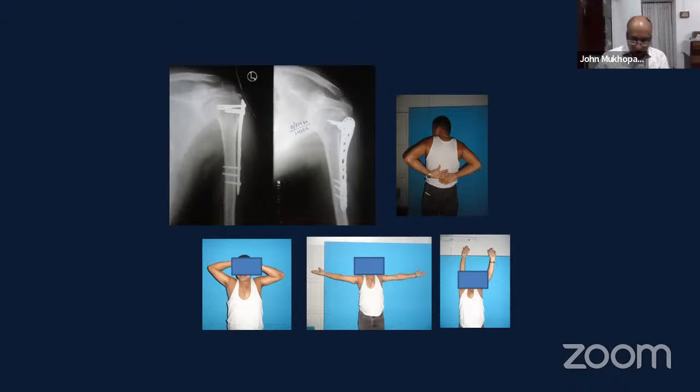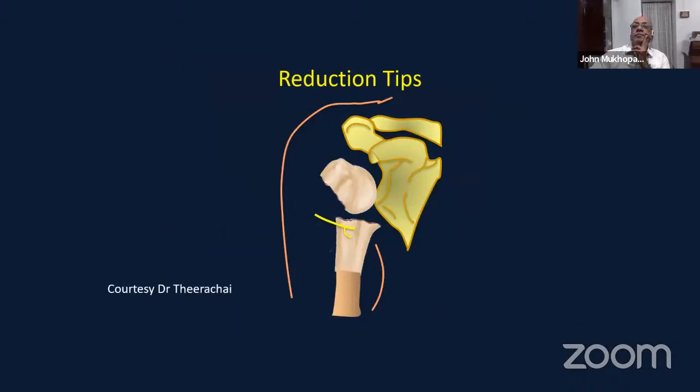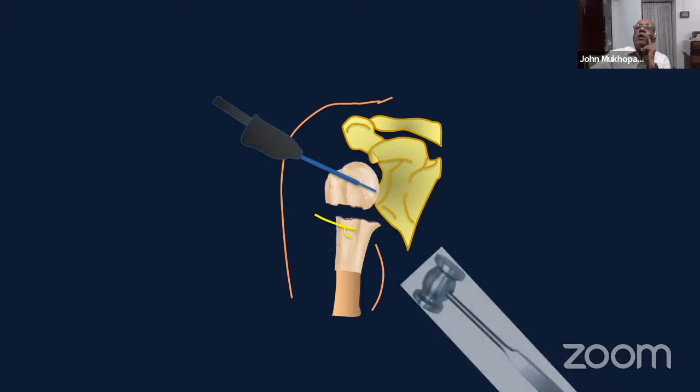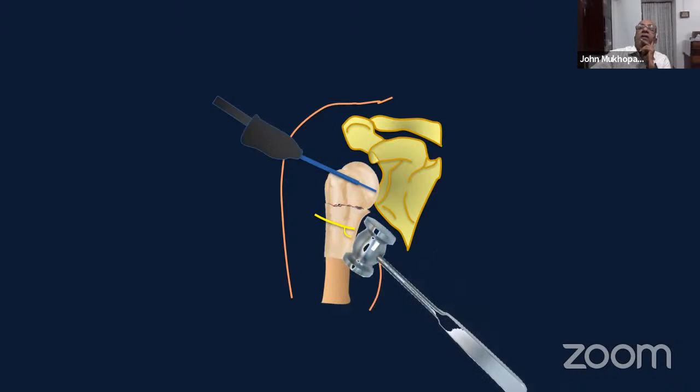So, as I mentioned, the other situation where we would use it would be shaft extensions. There are a few reduction tips for these proximal fractures where there are neck fractures. You can use things like traction. You can use a joystick onto the proximal fragment if it's going into varus and then tilt it into the valgus or the correct alignment position. You can use a mallet in the axilla to push the distal fragment more laterally.